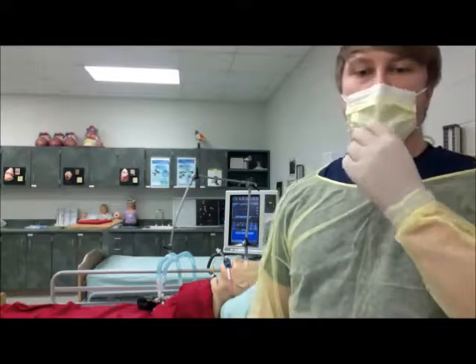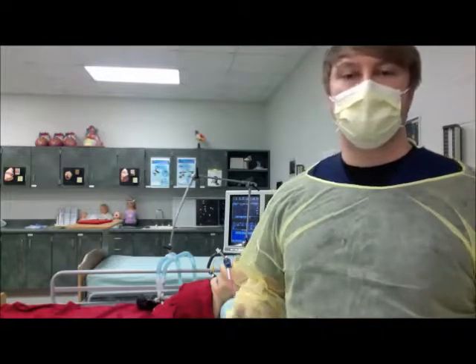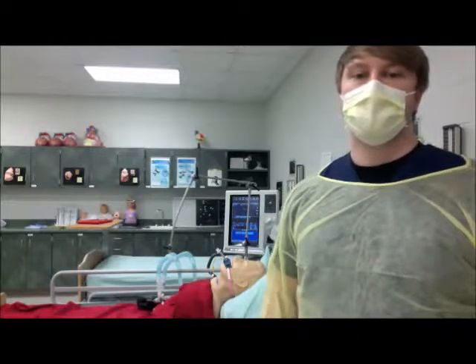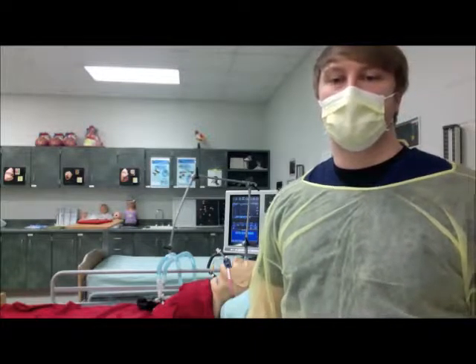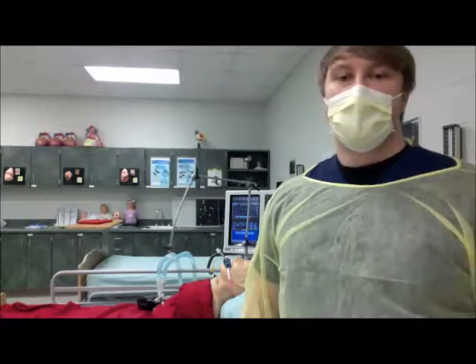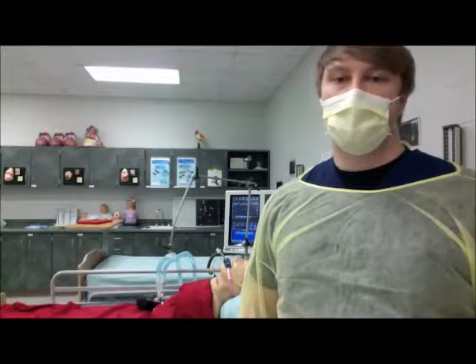We can do this via pulse ox, which normally in a normal healthy person is 92 to 100. For her, her pulse ox saturation should be between 88 to 92%, given her COPD status. The next non-invasive thing we can look at is carbon dioxide levels. And we can do this using an end-tidal CO2 detector.